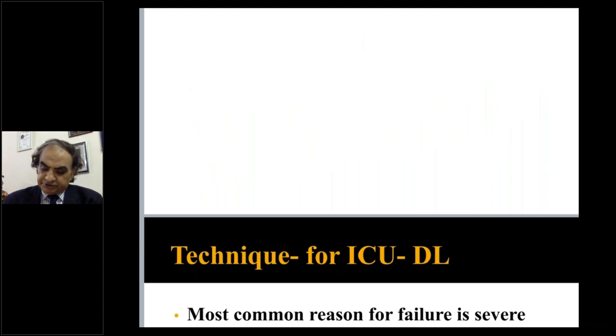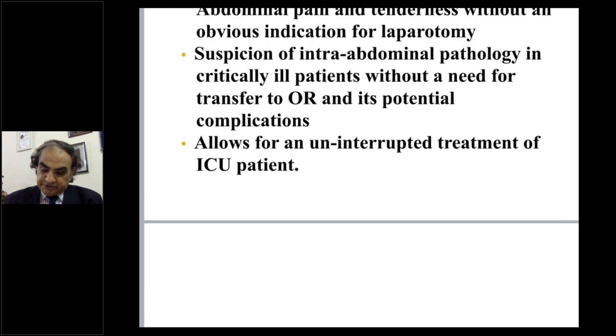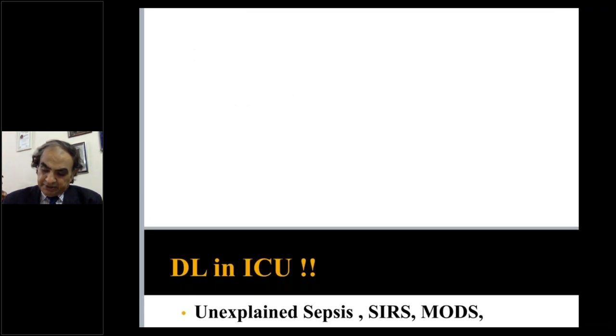Now, the technique, which is what you will be wondering, what do I do in the ICU? You see, the point is, you first of all got to have a diagnosis. Why are you doing it? It must be very seriously discussed. And don't just take a decision, my scope is waiting to do something, so let's put it into this abdomen. That's not what we want to do.